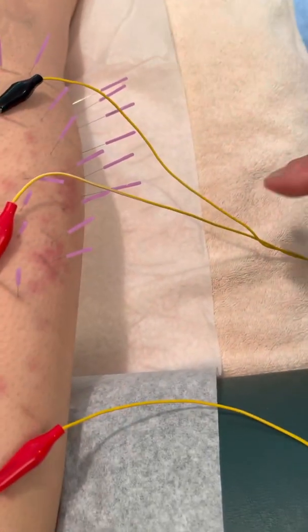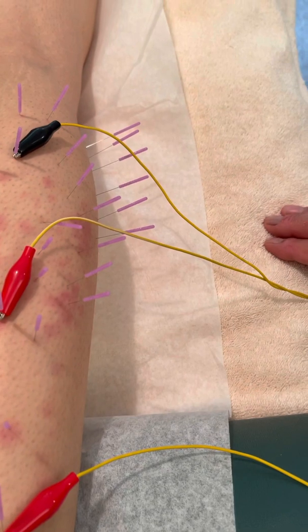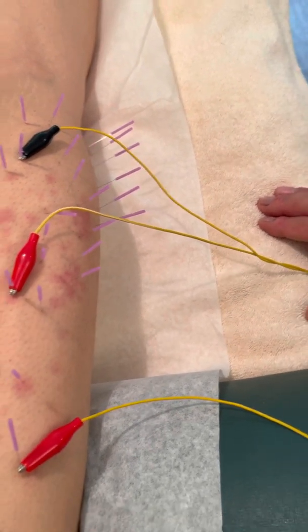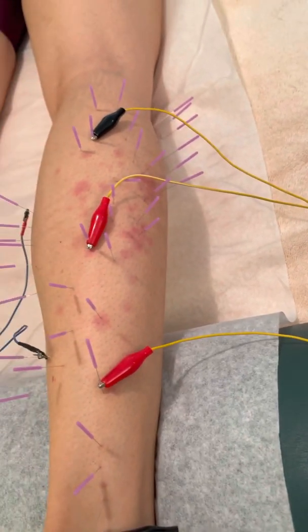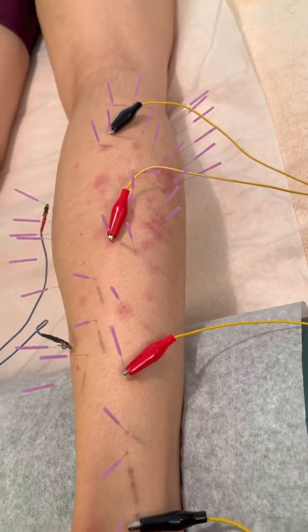How are you doing with the electrical stim now? It could be stronger, actually. It could be stronger. So what happens is, after it's been on for a little bit, often people ask me to make it stronger because they get used to it.